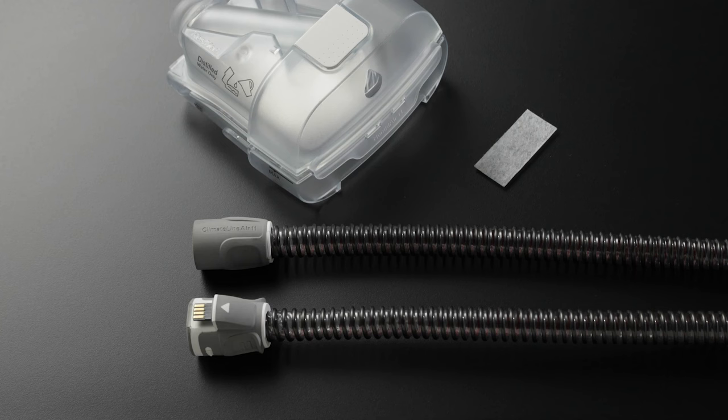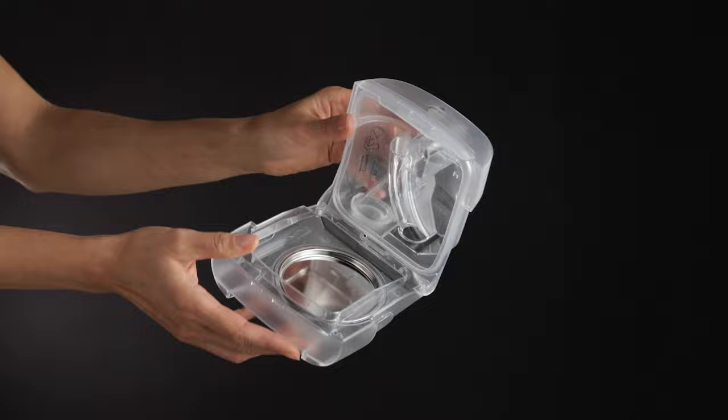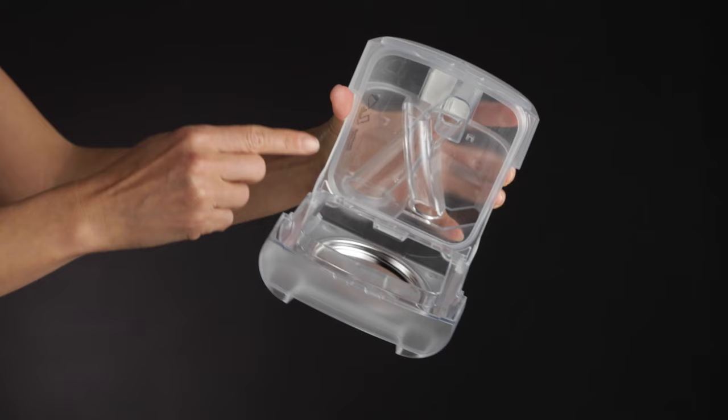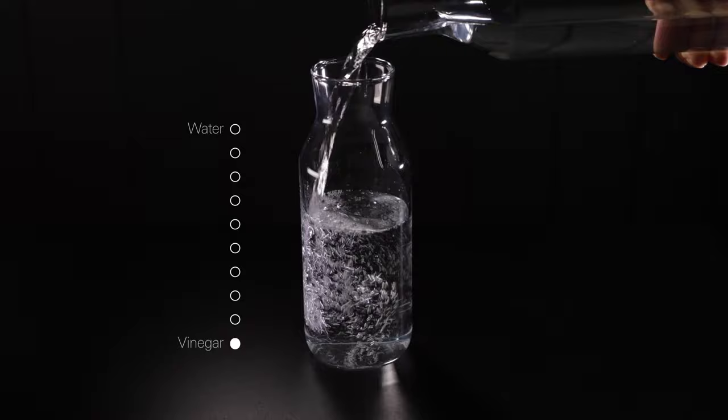Checking. Regularly check the humidifier tub, air tubing, and air filters for any damage. Check the humidifier tub. Replace it if it is leaking or has become cracked, cloudy, or pitted. Replace it if the seal is cracked or torn. Remove any white powder deposits using a solution of 1 part household vinegar to 9 parts water.